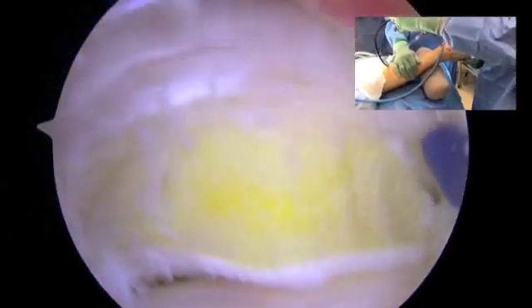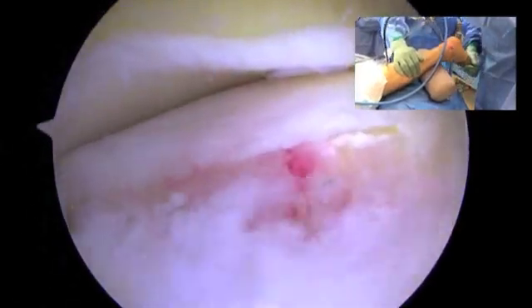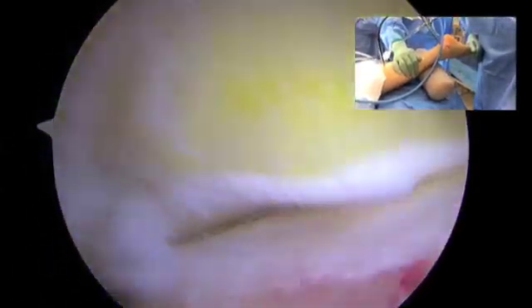Plantar flexion again please, as far as we can. Margin looks good. Articular surface also looks good there. Go back the other way.